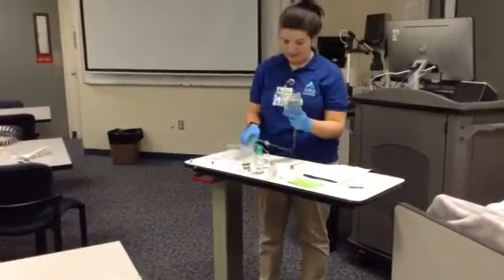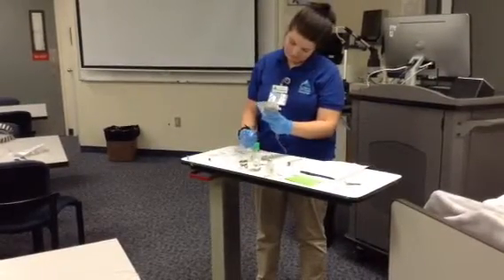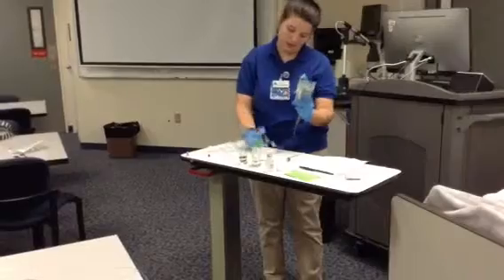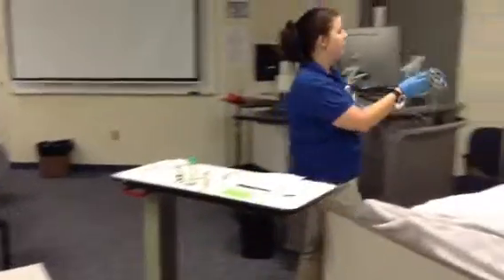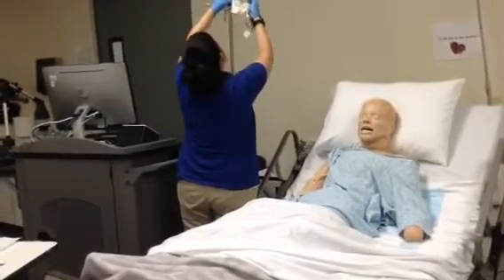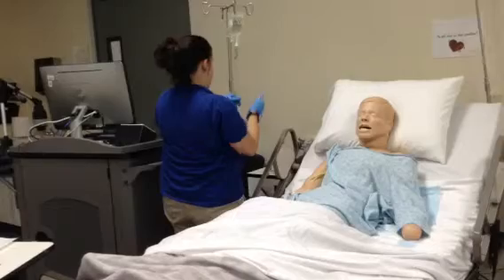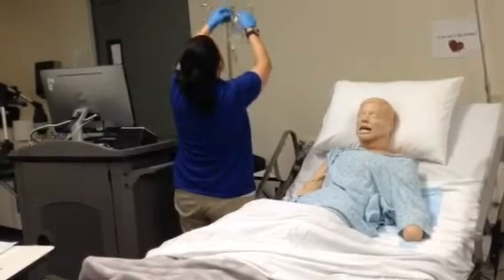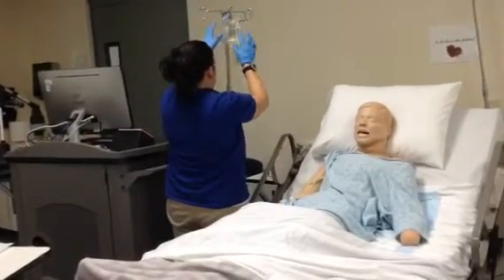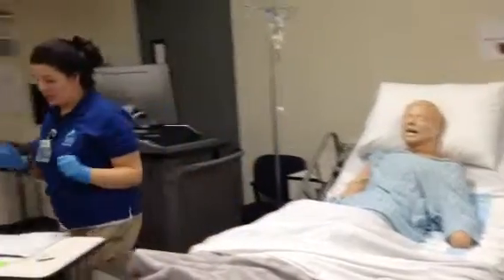Alright, now let me go ahead and hang this back. Okay, hang my medication over here, this side, so they know what saline it is. You doing alright, Miss Jackson? Okay, that's ready for when it's time to do the medication.